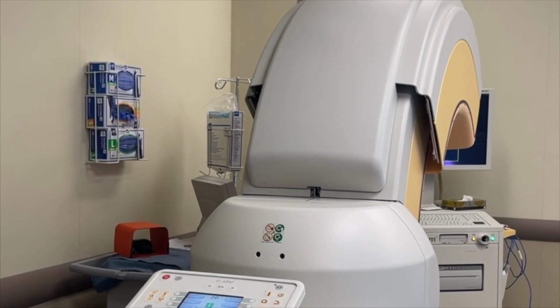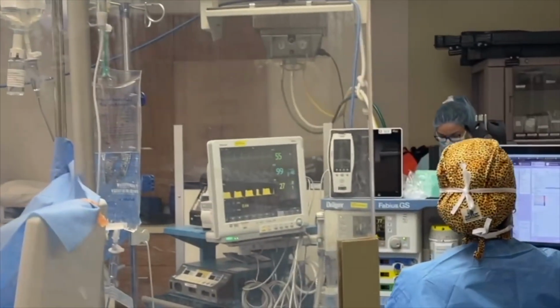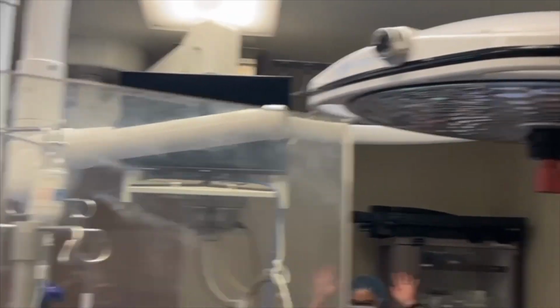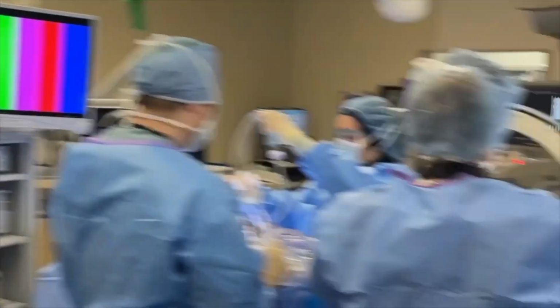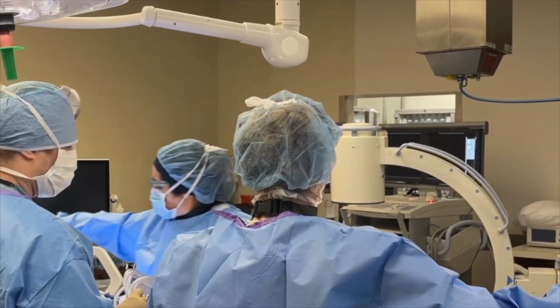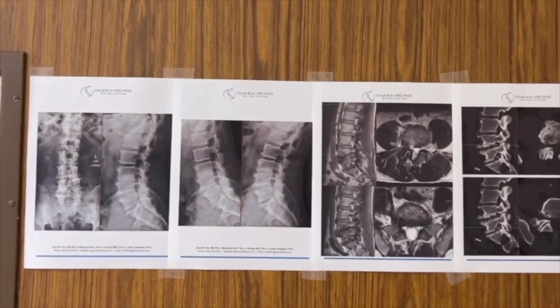Choll Kim here from sunny San Diego, California. We have the Formula One blue team and everything but the kitchen sink. So we've got neuromonitoring over in the corner. We've got navigation, the endoscopic tower, intraoperative imaging, and the FOSS, Luke, the FOSS. Because we have to do a really, really, really good job.